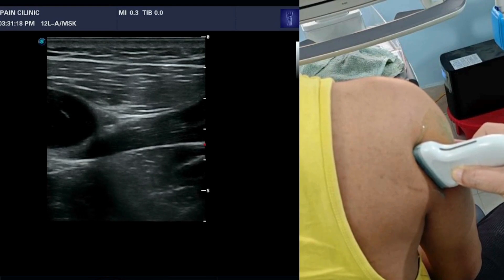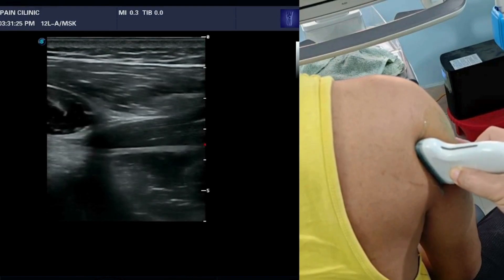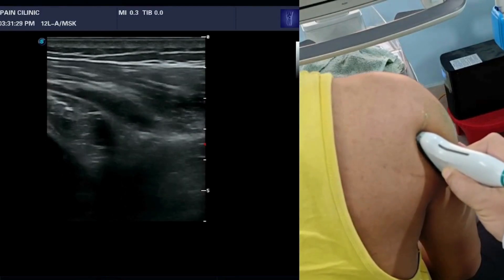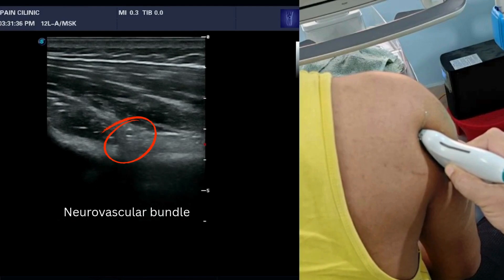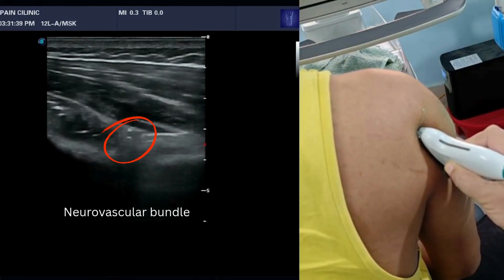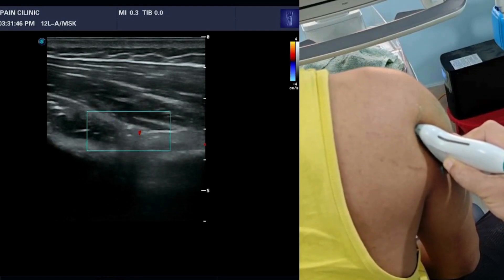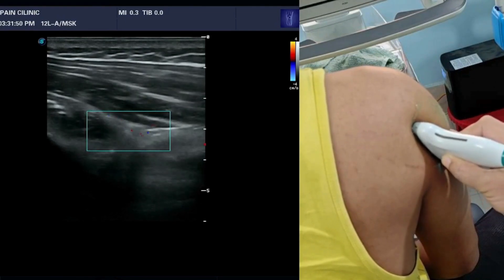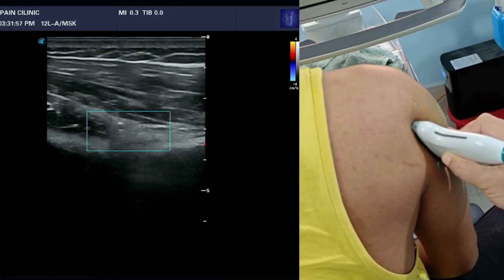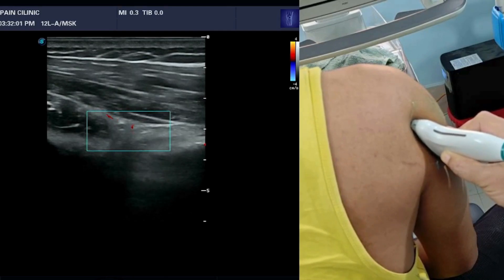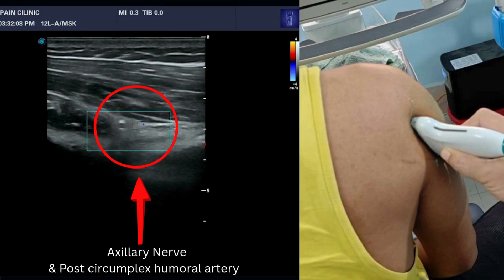Then comes the third step: putting the probe in the same position and making an oblique view towards the quadrilateral space. In this oblique angulation, pulsating vessels become visible in the middle of the screen. Adding color Doppler confirms pulsating vessels in this area — this is the quadrilateral space with its neurovascular structures, including the posterior circumflex humeral artery and the associated axillary nerve.